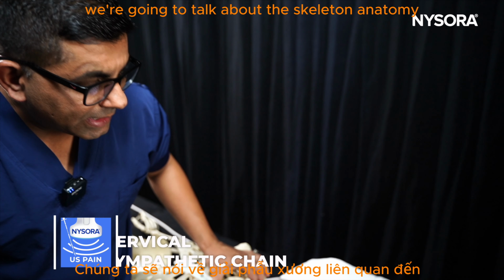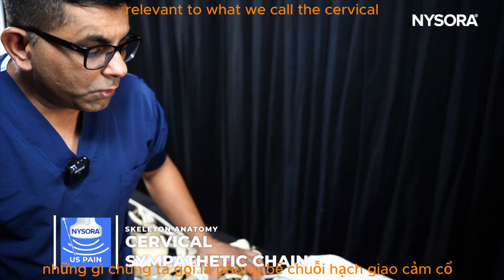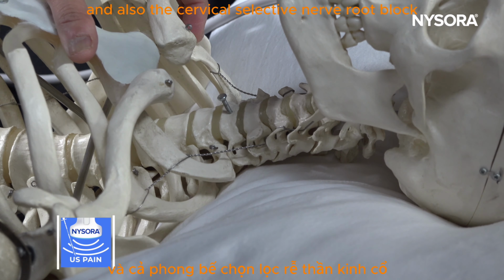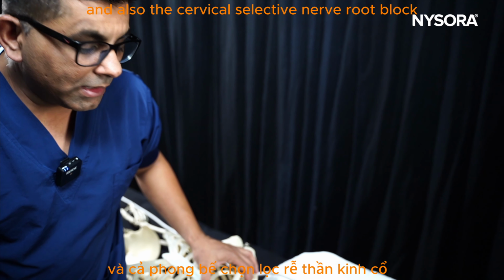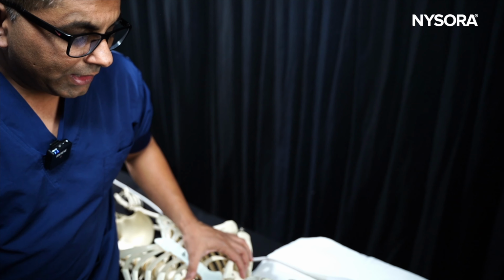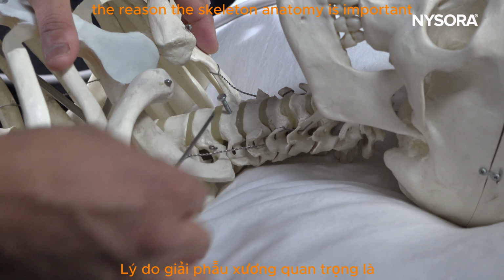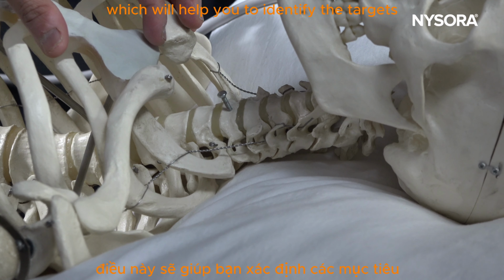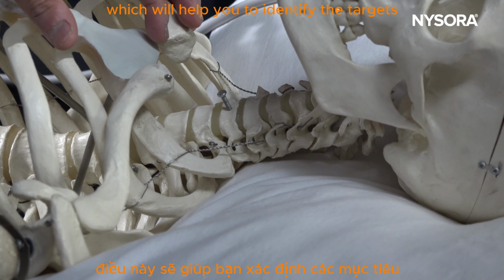We're going to talk about the skeletal anatomy relevant to what we call a cervical sympathetic chain block, and also the cervical selective nerve root block or extraforaminal injection. The reason the skeletal anatomy is important is because when we do the scanning, you're looking for the bony silhouettes, which will help you to identify the targets.